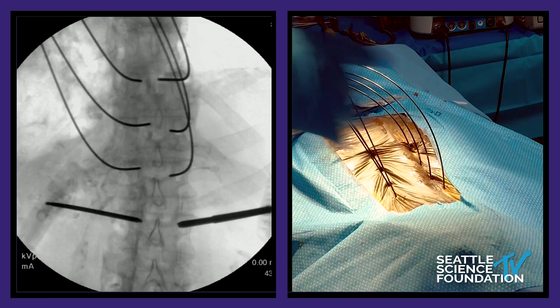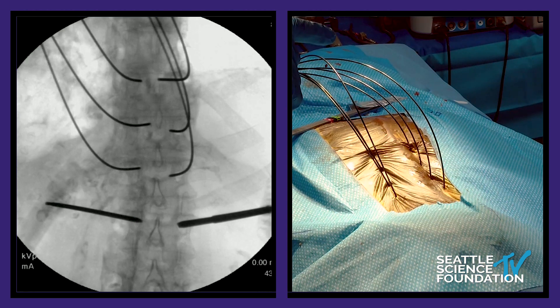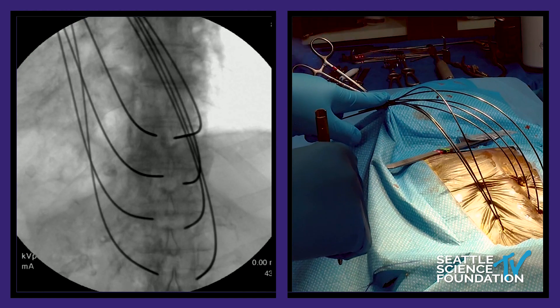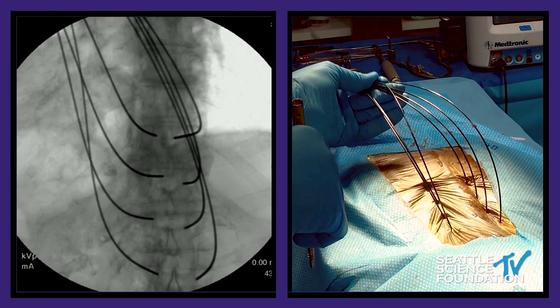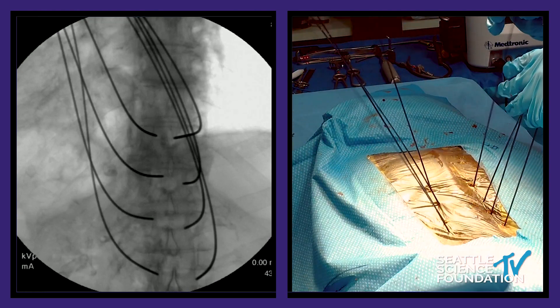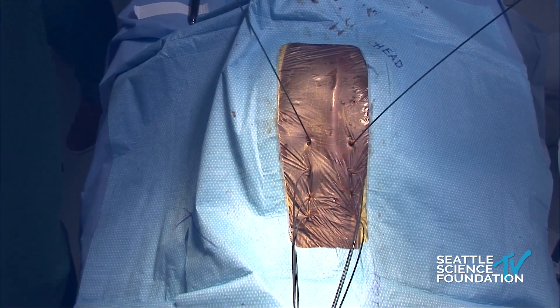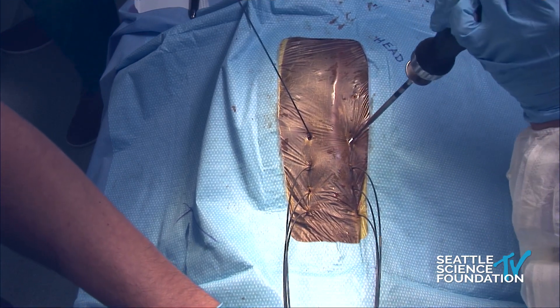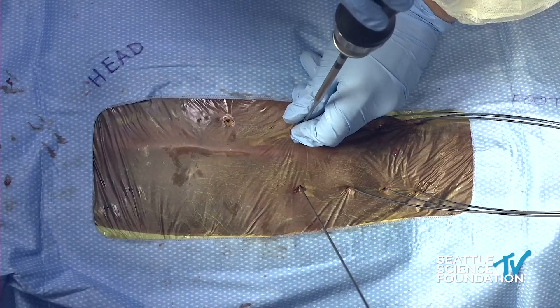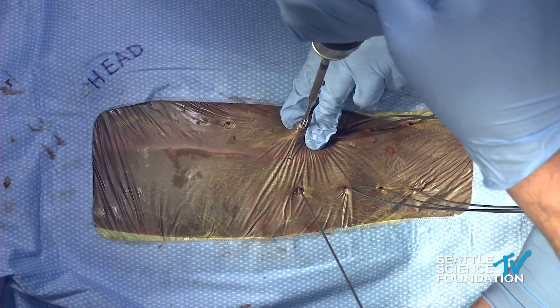Just for time, let's go ahead and tap the top screw. Victor, why don't you get one final shot before you leave. Can you guys see the arrangement of the wires? I basically put a snap on — perfect. Now we're going to loosen the wires and Victor's going to come out. This is actually what it looks like during surgery — you've got a bunch of wires that you have to control. Mauricio is going to go ahead and tap this. Usually when we do this I have a lateral fluoro as well, so while you're tapping you want to make sure you're not advancing the wire.